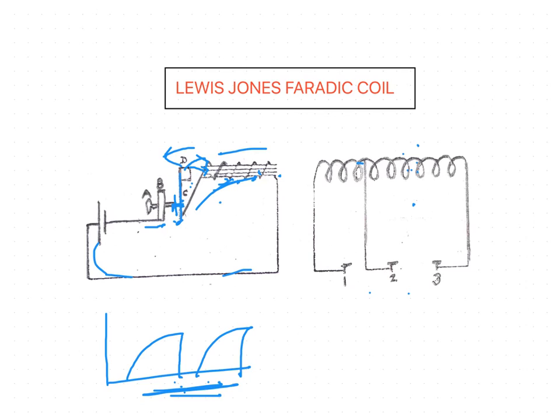If terminals 2 and 3 are used, 2/3 of the coil is used and 2/3 of the EMF is available. While with terminals 1 and 2, 1/3 of the EMF is used.